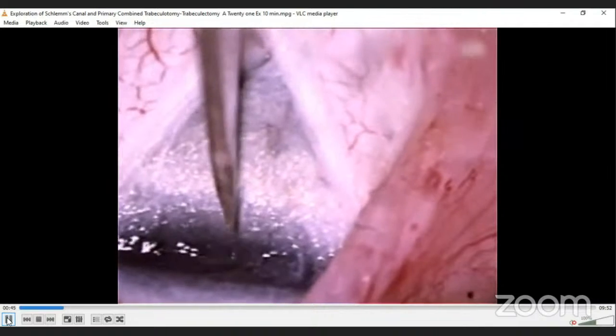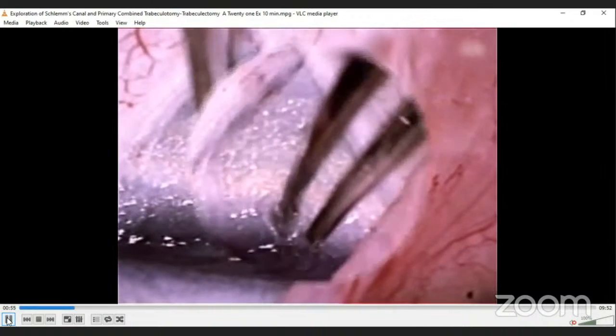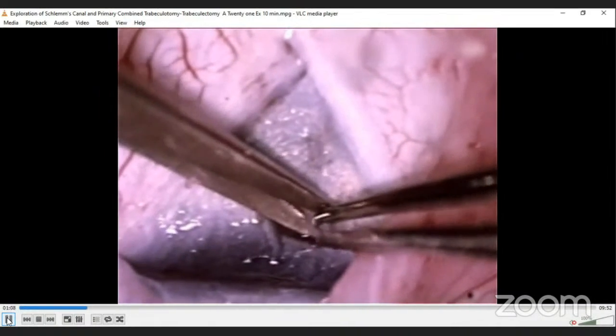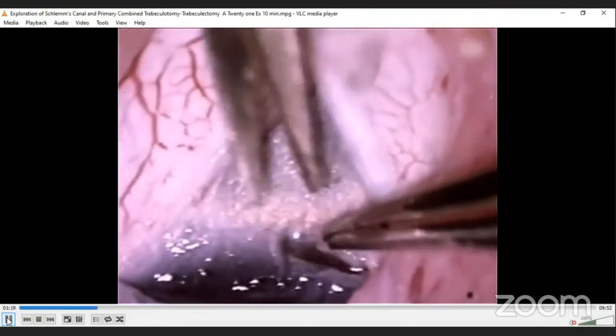You can see here a radial incision is given on the external aspect of the scleral spur to cut open the superficial wall of the Schlemm's canal. This step, although not part of the surgical technique of trabeculotomy, is just to explore the Schlemm's canal, how by external dissection we can beautifully explore it on either side of the radial incision.